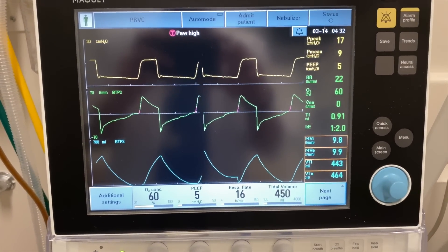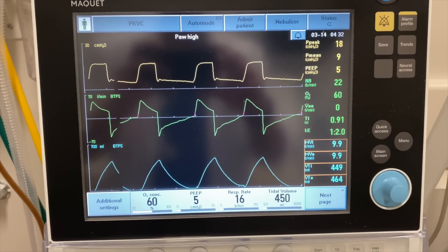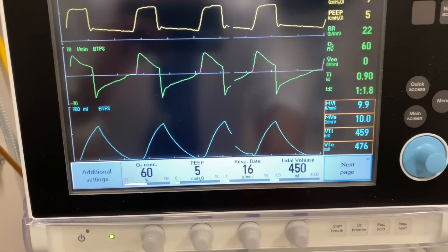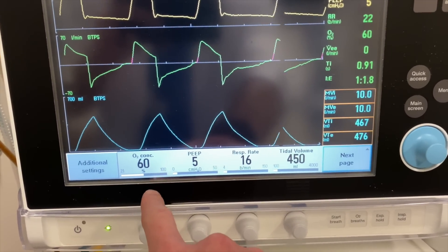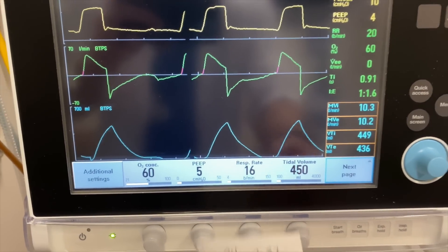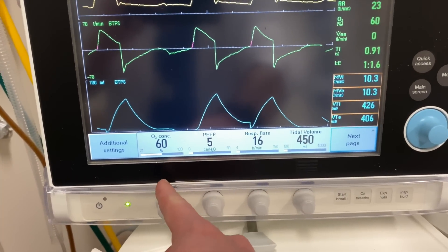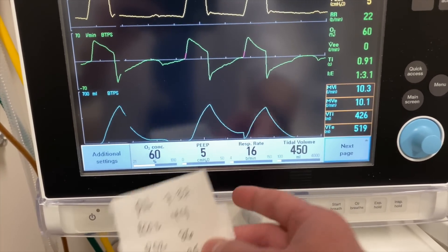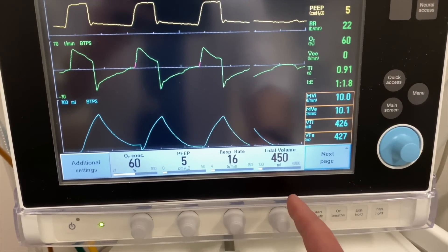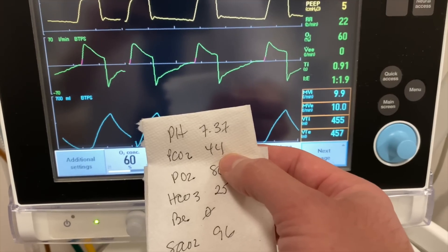A lot of things could be used on the Puritan Bennett's and Draeger's etc. But the first thing I want to focus your attention to are these four knobs down here, these four buttons, which are the FiO2, the PEEP, the respiratory rate, and the tidal volume. The first two knobs — O2 and PEEP — are what controls the PO2. And then the respiratory rate and the tidal volume are what controls the PCO2, the carbon dioxide level.